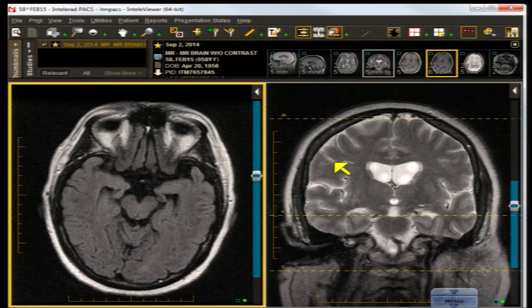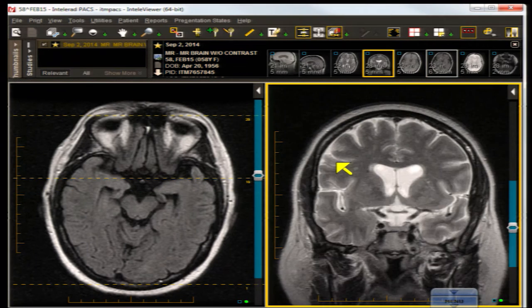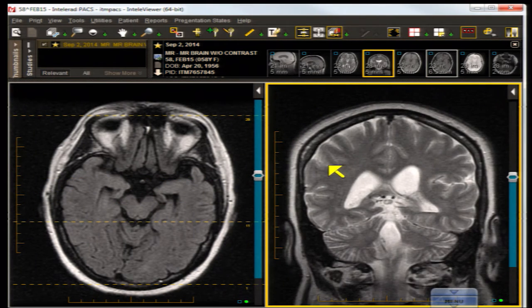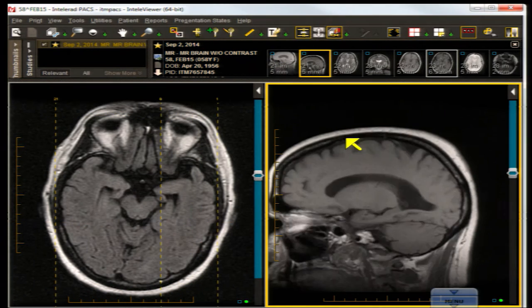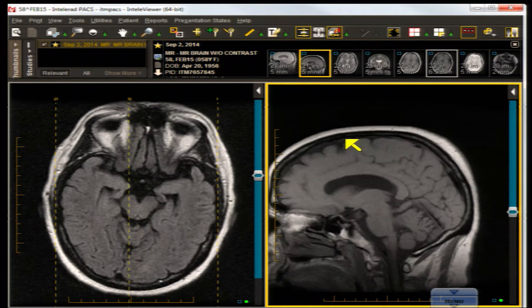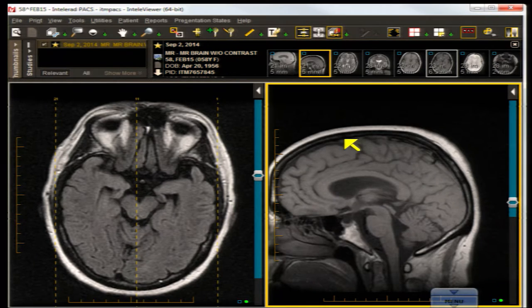In terms of the cerebellum, there really wasn't much cerebellar atrophy at all. Let's look at the sagittal midline cut to reaffirm that. Indeed, there is very little to no cerebellar atrophy.